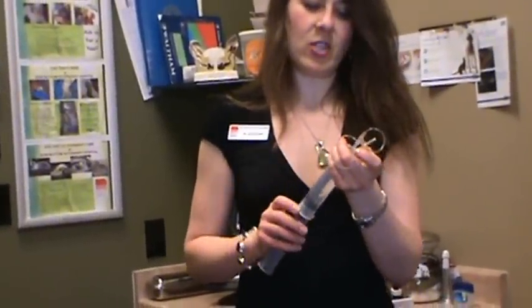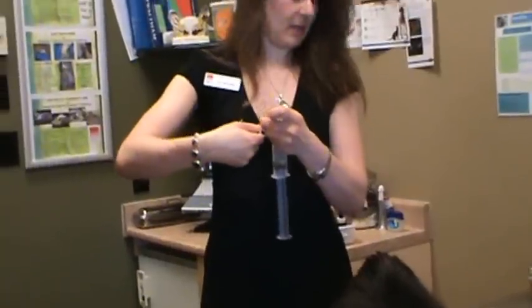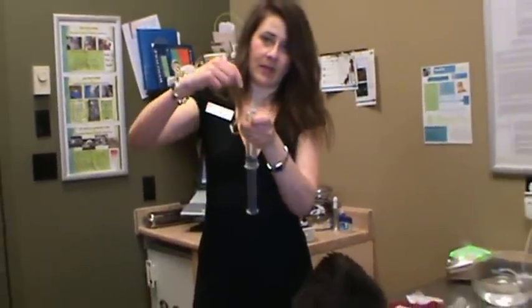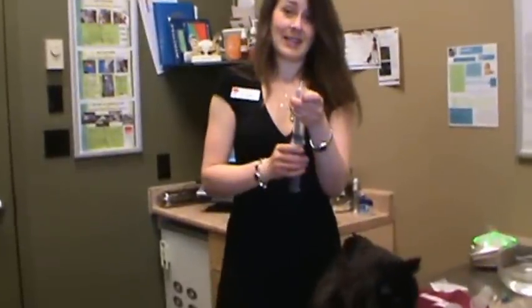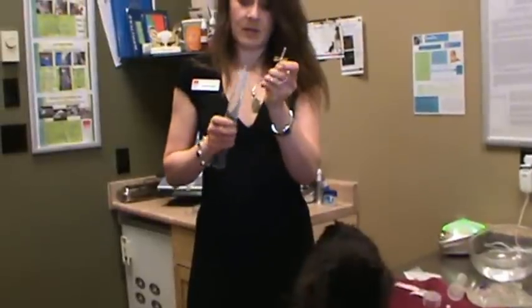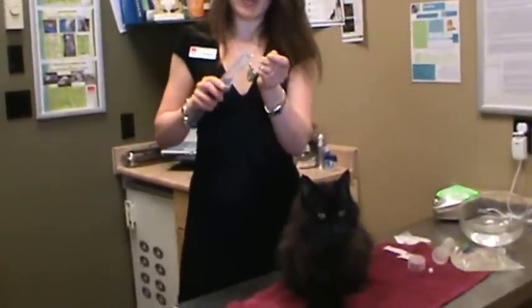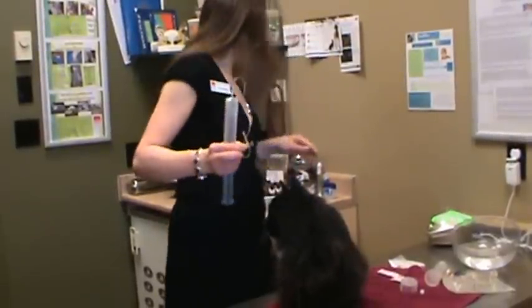Now if we're giving a vitamin B injection, I'll often just undo the 18 gauge needle and push the vitamin B. Usually it's about 0.1 milliliter of vitamin B and that's something we like to give under the skin as well. That helps restore their appetite and vitamin B levels. Vitamin B is like a happy vitamin — it makes the cat feel a lot better.